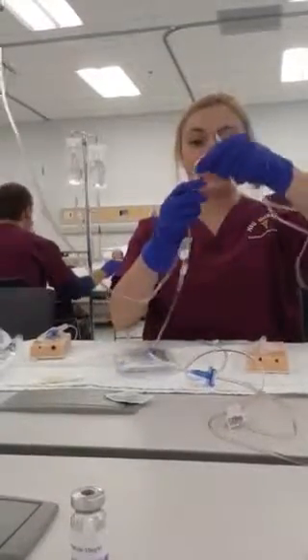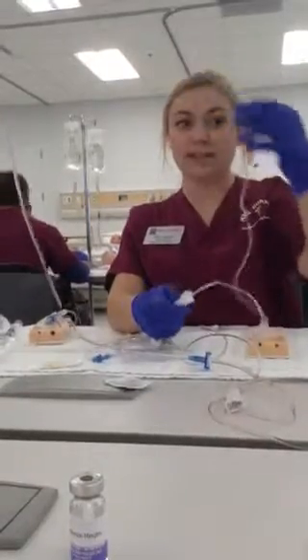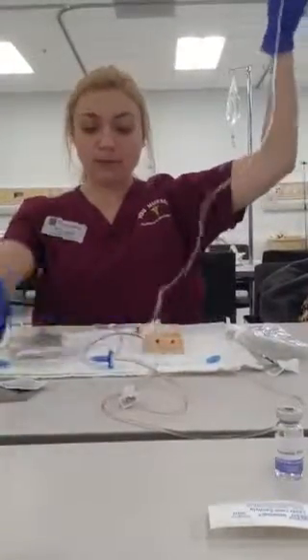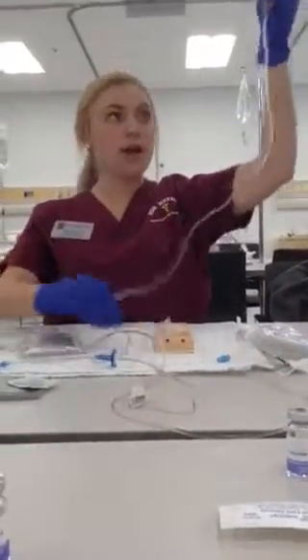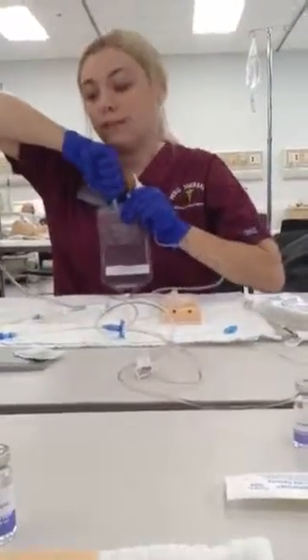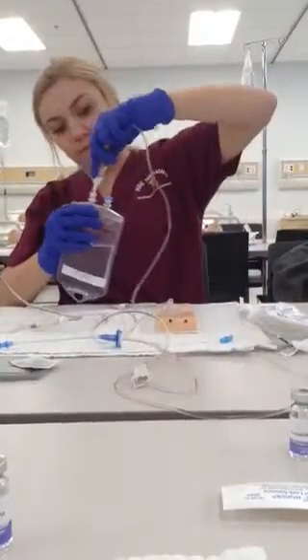And then to prime my tubing, I'm going to go ahead and open it all up and let it fill up with the normal saline so I don't waste any of the antibiotic. So I can see that there's no bubbles in any of my primary tubing or my secondary tubing, and my tubing has been primed. So I'm going to take the cap off my antibiotic and then spike the bag.